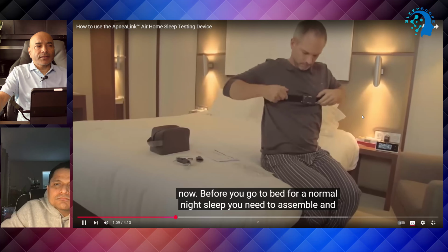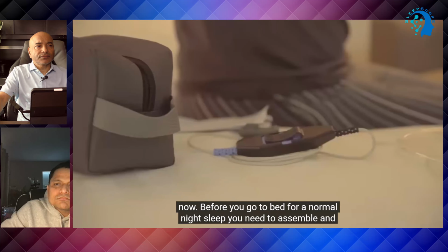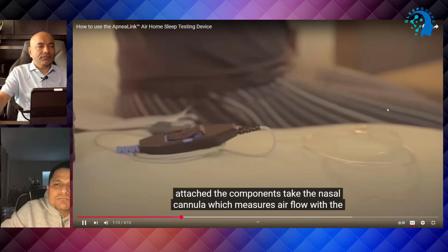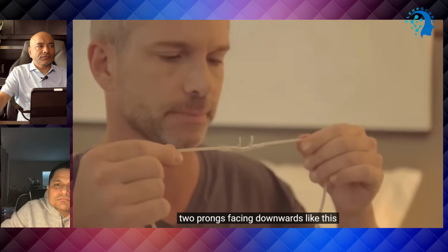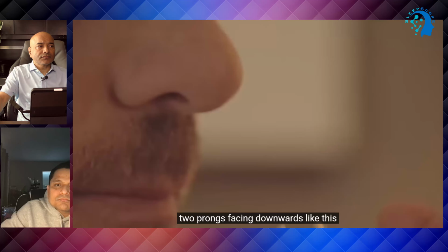Before you go to bed for a normal night's sleep, you need to assemble and attach the components. Take the nasal cannula, which measures airflow, with the 2 prongs facing downwards, like this.